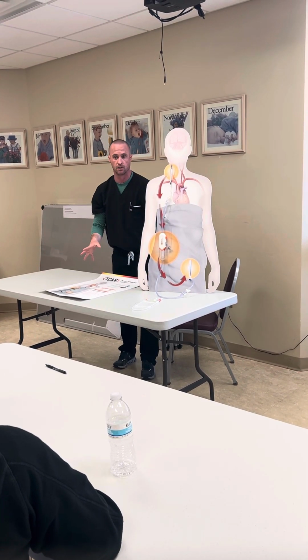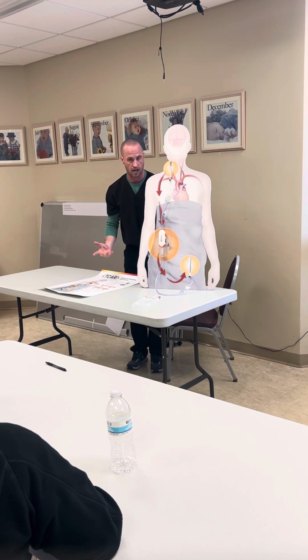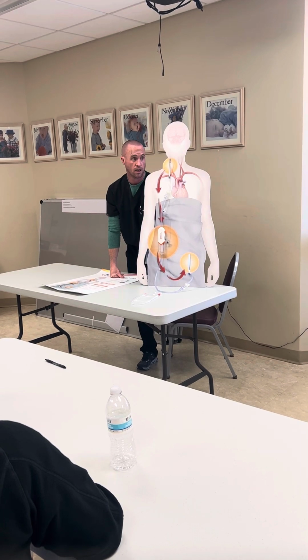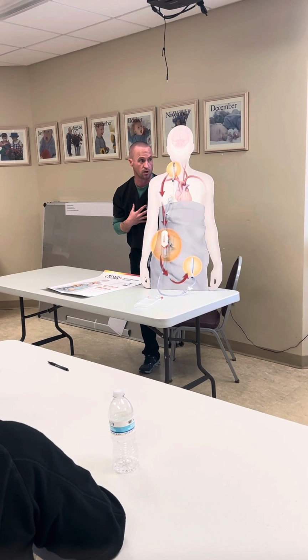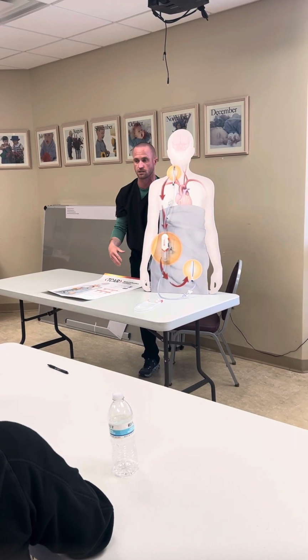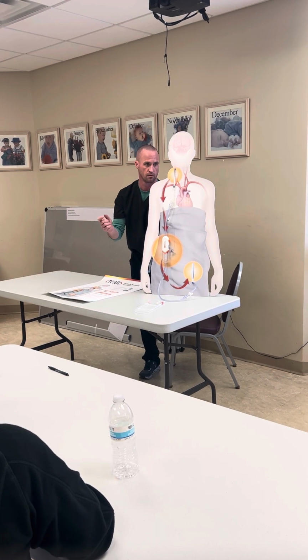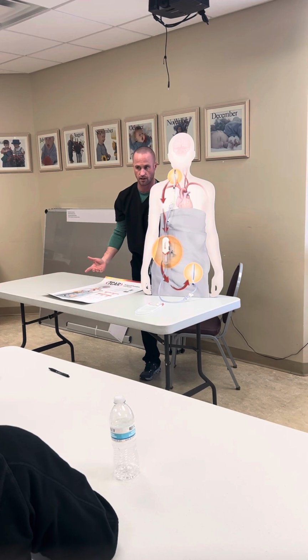Average case time is 45 minutes for Dr. Reiser, 60 in the nation. And average clamp times are 10 or less. So we're not on flow reversal very long. We work these cases up via CT imaging, and we're pretty thorough about depths, access lengths. The one we're doing Wednesday, I sized it myself. It's great. I think we had 6 or 7 centimeters runway length. We had probably a depth of about 3.5. Everything else measured out nicely.